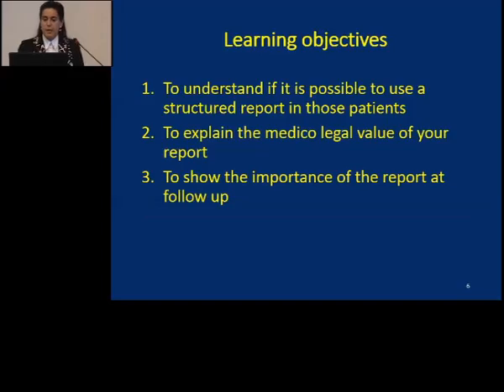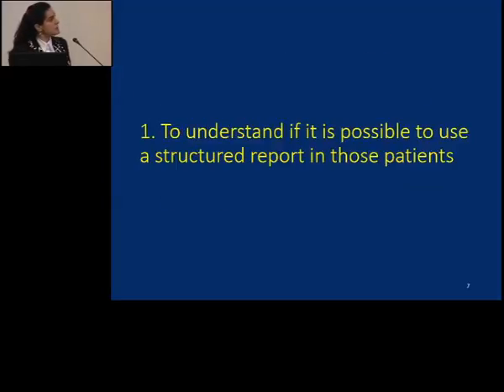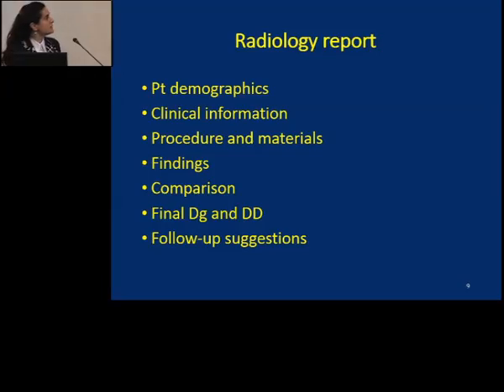So the learning objectives of this lecture are these main 3, and we will start with the first one. Is it possible to create and to use a structured report in those patients? Okay, we start. So what is a radiology report?